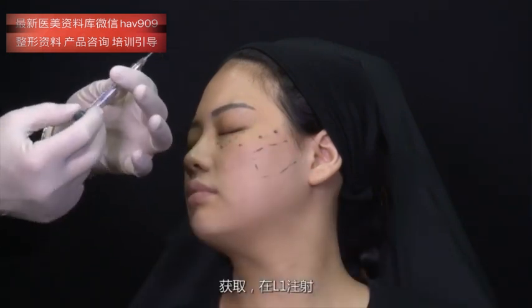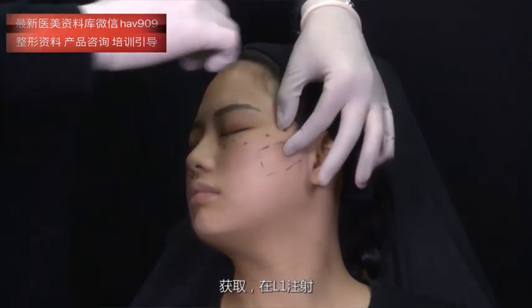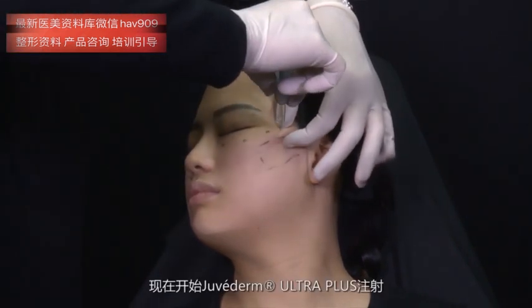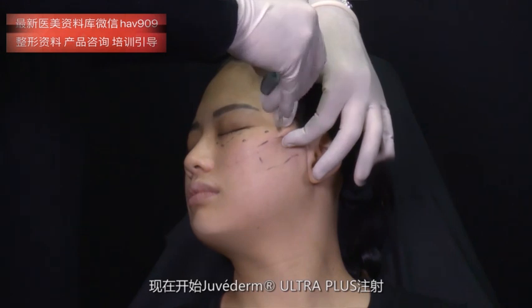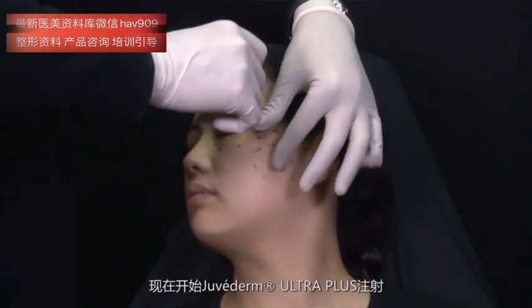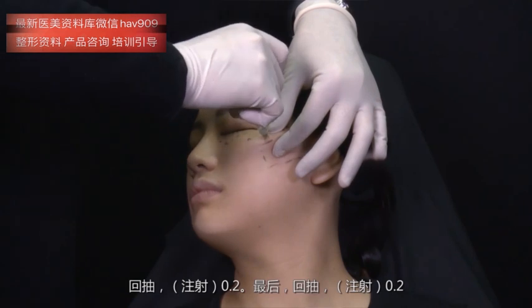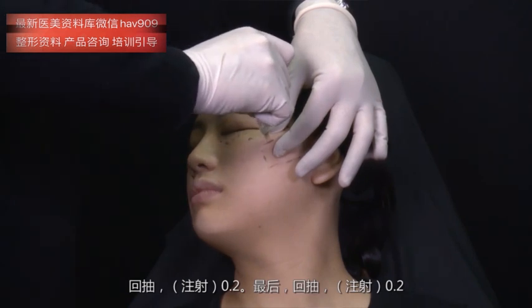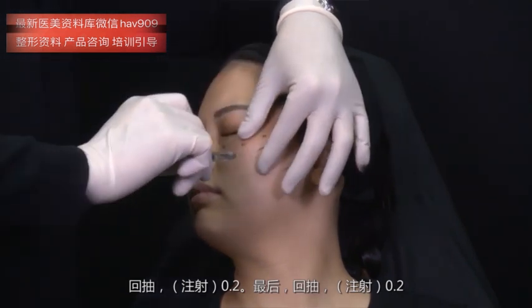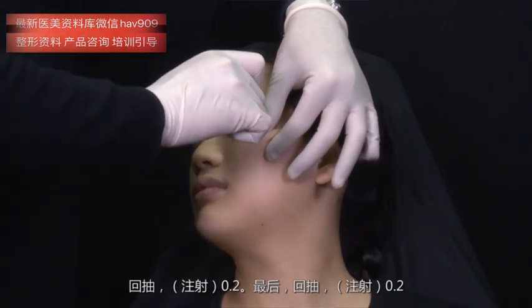Injecting in L1, deep, and aspirating, injecting 0.2, aspiration, 0.2, and finally aspiration, 0.2.